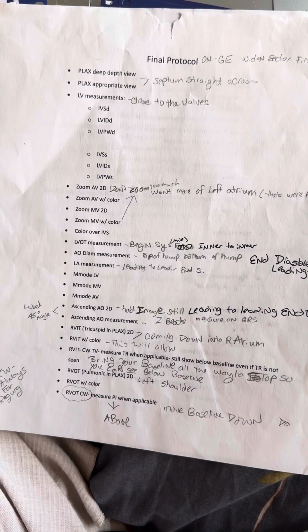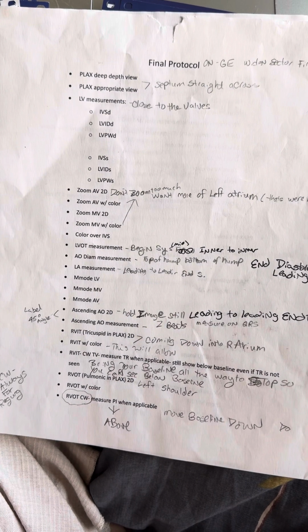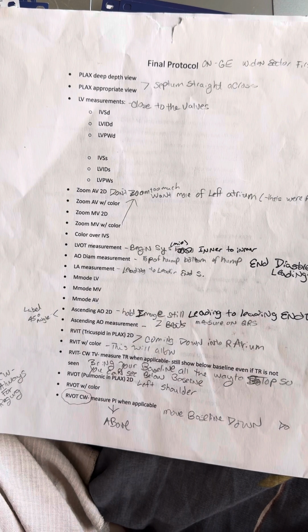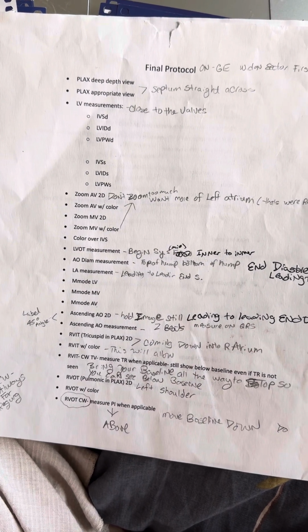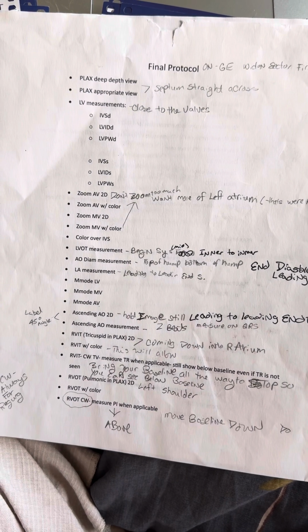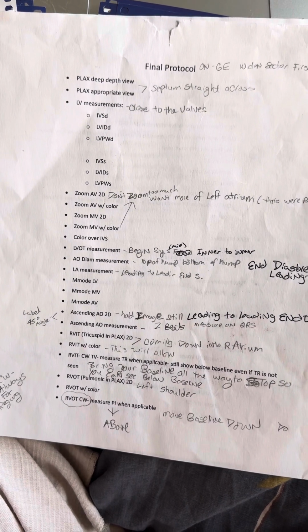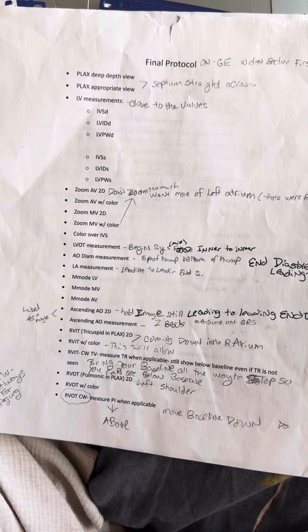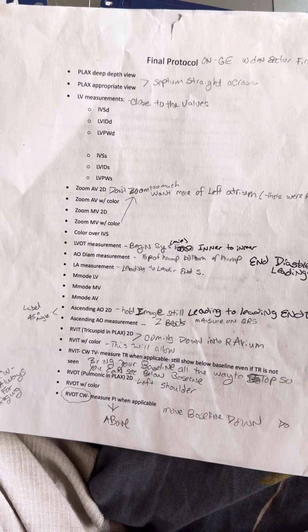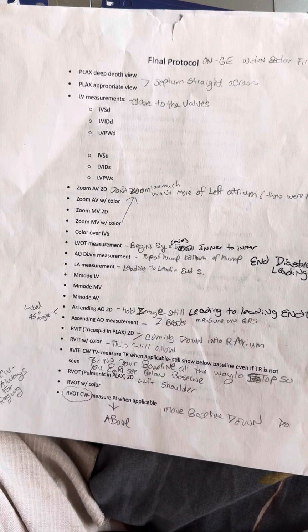Next, color over IVS. LVOT measurement is next. It is in beginning or mid systole. Measure inner to inner.